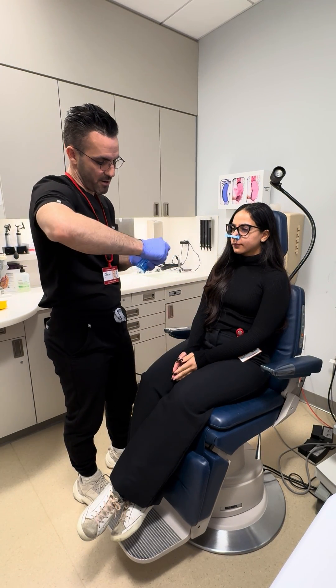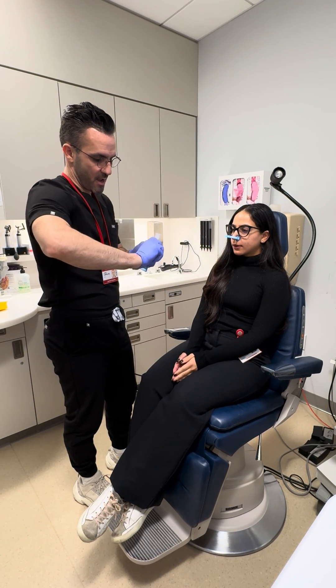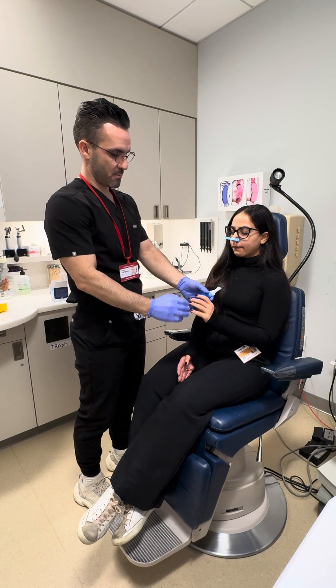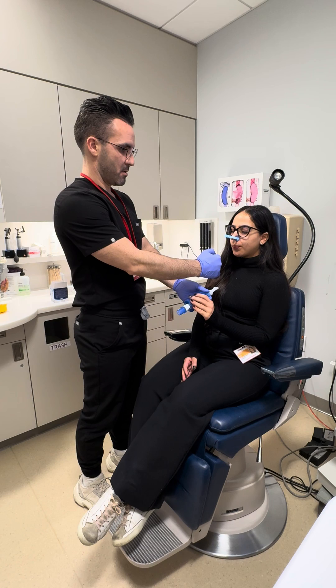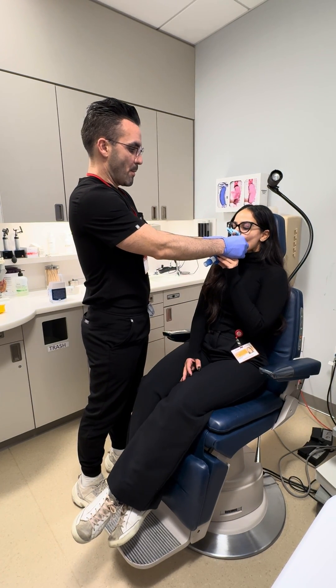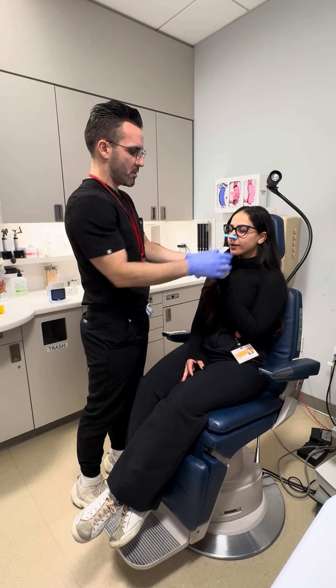Alright, I'm going to make it a little harder — move this up to around 90. Low. Stop, bite and suck in — go, go, go, go, go, go, go, go, go, go, good.